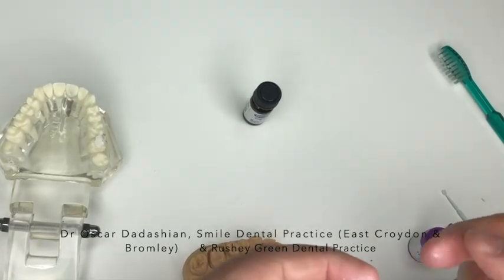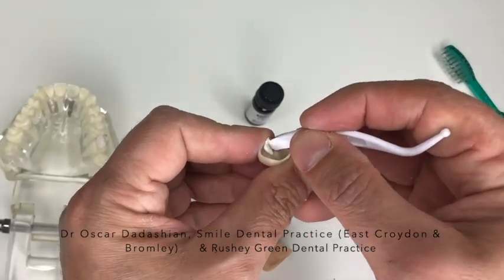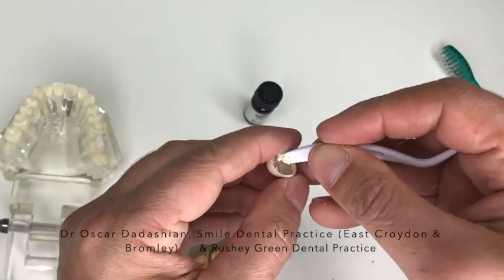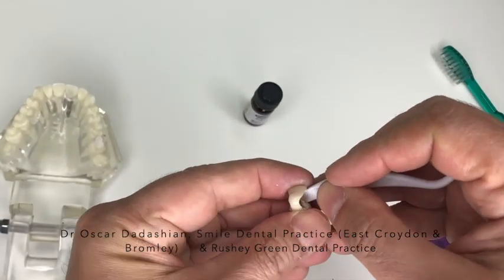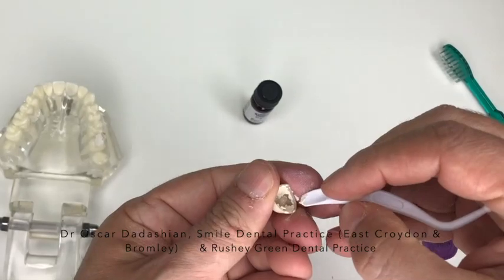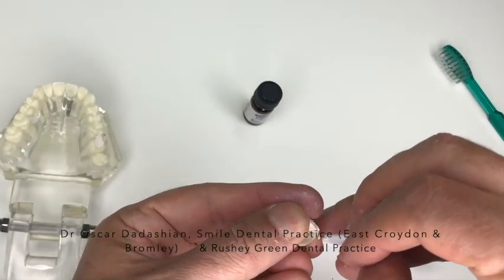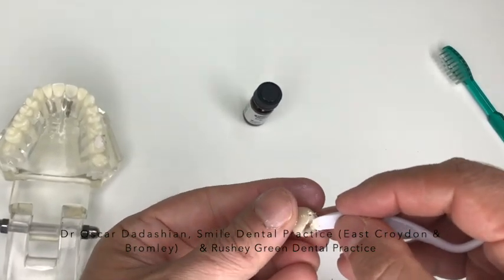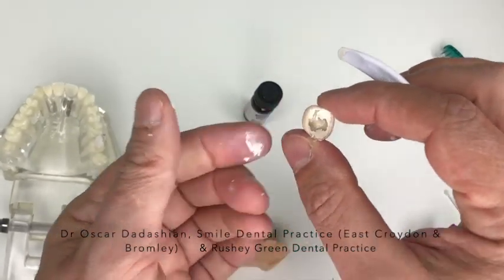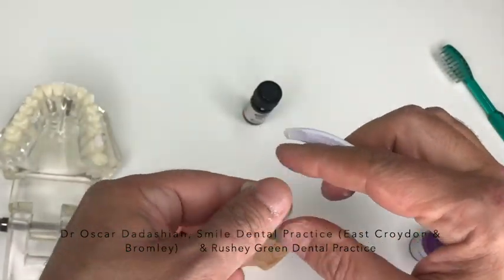And I'm just going to put that inside. So once it's in there, I'm going to just make sure that I spread this out. You don't need much. If you put in there a lot of material, then it's going to be hard to keep it clean. So make sure you basically just spread it out, put it a little bit everywhere. Very thin layer. Preferably you want to make it as even as possible. As you can see, I haven't necessarily filled the inside of it, but I've done the edges, the side of it, because that's the most important part.